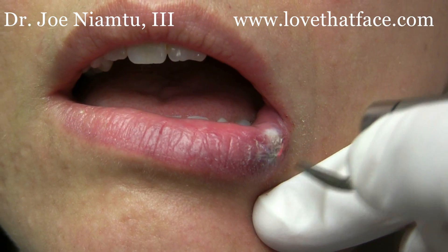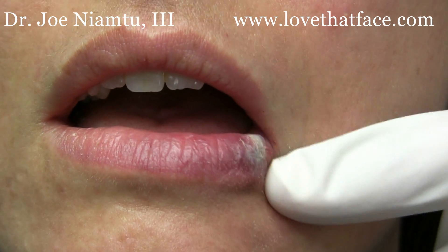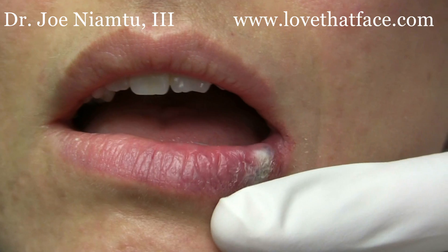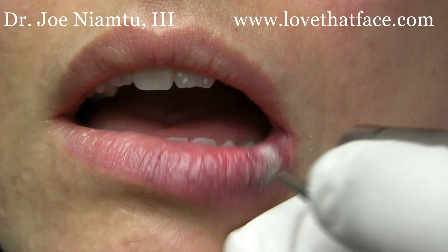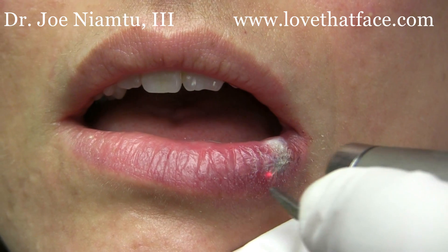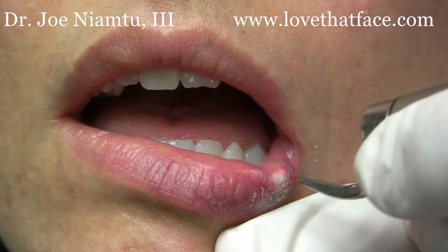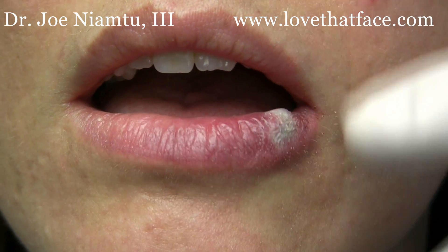The patient will probably have some ulceration here, but you can see how much that is — that's about a 50% reduction just with that little treatment, and you can see how it really takes away the blue hue from the venous structures underlying.